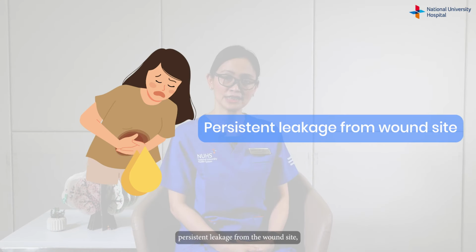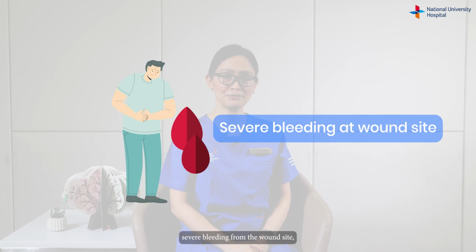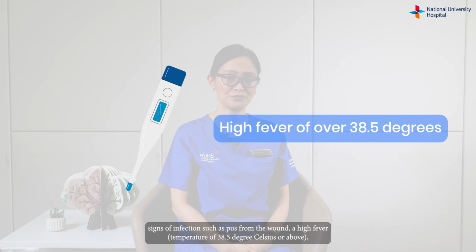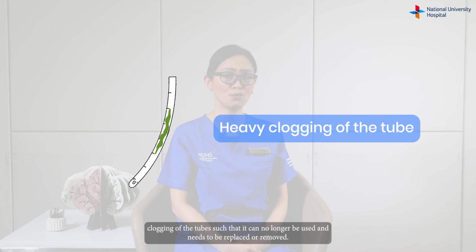Persistent leakage from the wound site, dislodgement of the tube, or if the tube tears, severe abdominal pain, especially after feeds, severe bleeding from the wound site, signs of infection such as pus from the wound, a high fever with temperature of 38.5 degrees Celsius or above, persistent nausea, vomiting, diarrhea, or constipation that lasts for 5 days or more, clogging of the tube such that it can no longer be used and needs to be replaced or removed.